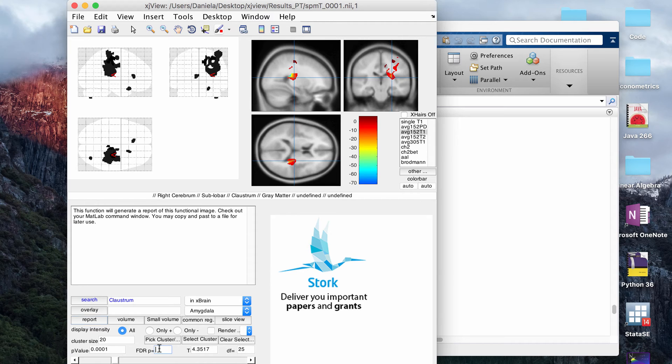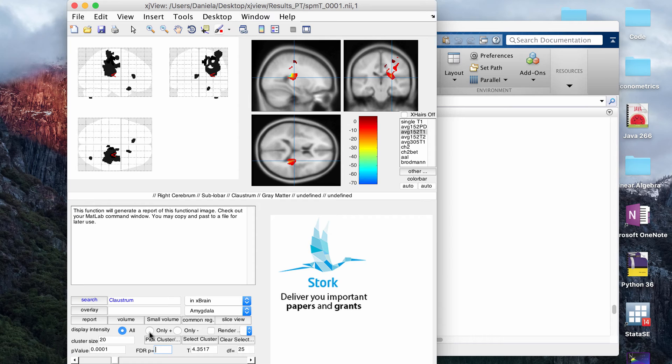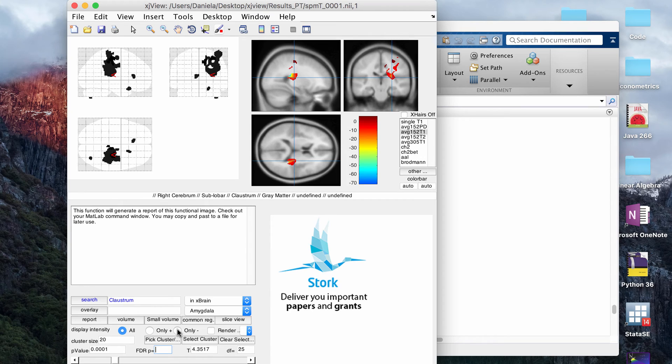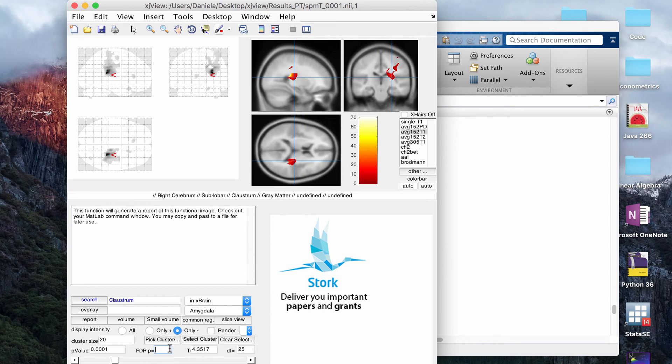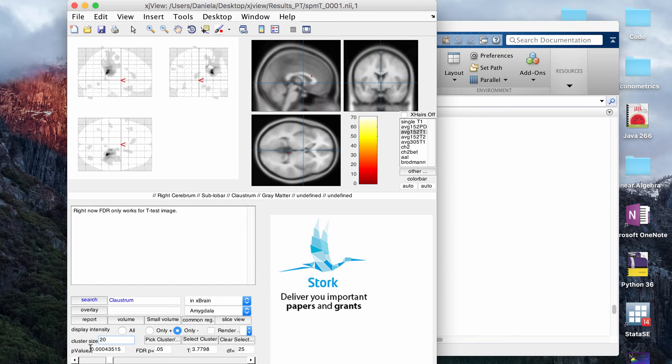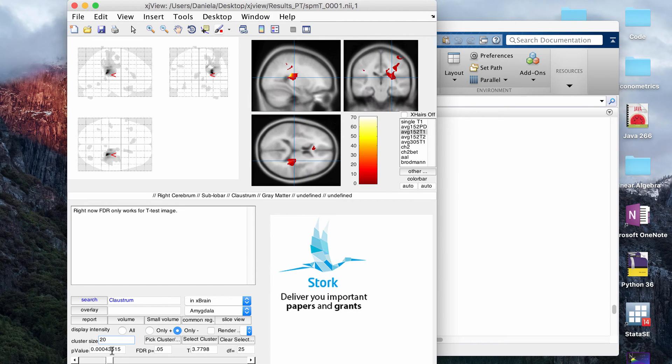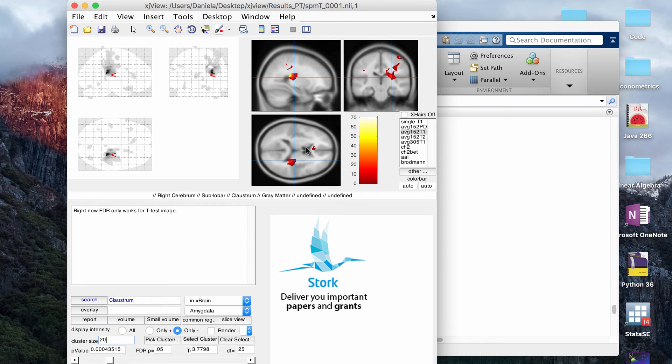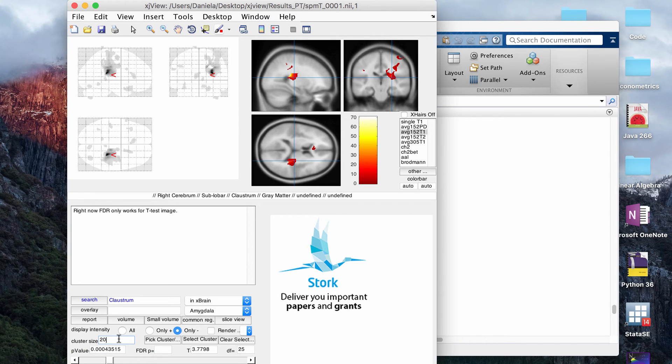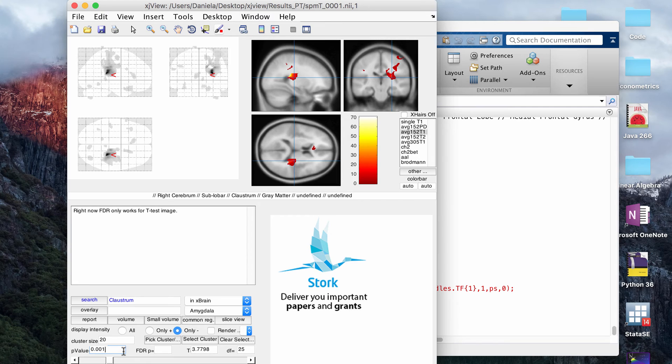For this here, for false discovery rate, if you want to do that, you first have to pick whether you're looking in the positive clusters or negative clusters, because you'll get an error if you try to do both at the same time. If I do negative, then you can put a false discovery rate, for example 0.05, and that will update the p-value that you need and show you if any of the voxels still meet that p-value requirement. As you can see, it changed it automatically. If I erase that, then I can go back to manually fix whatever p-value I wanted, and it will go back to the way it was.